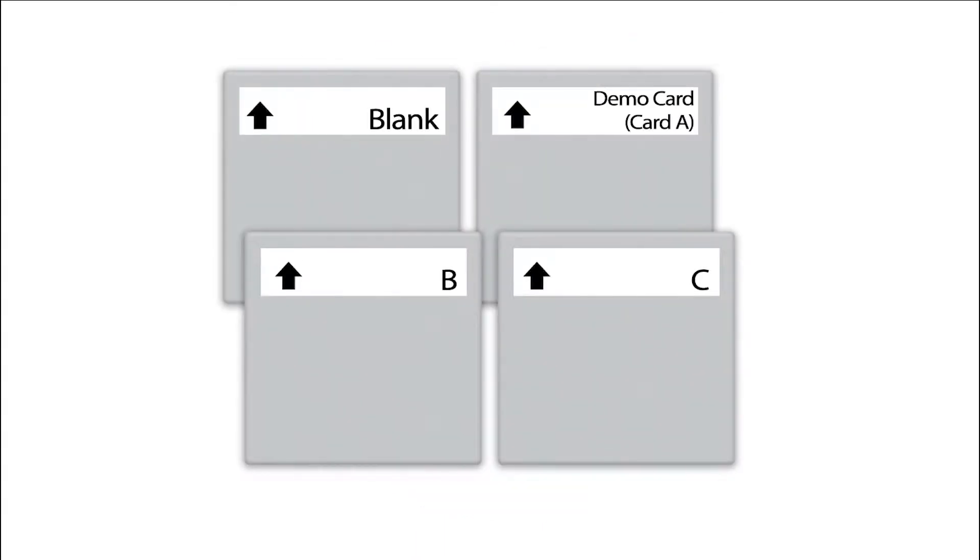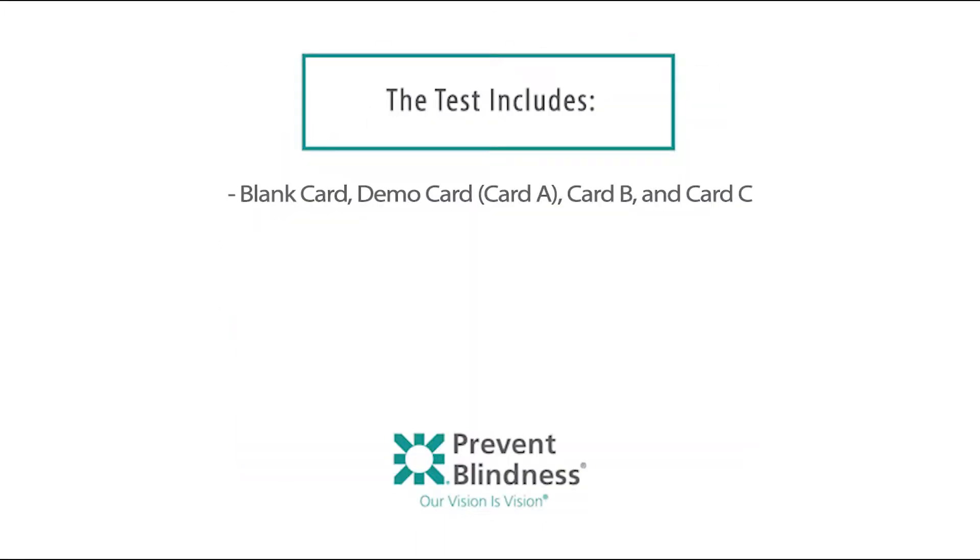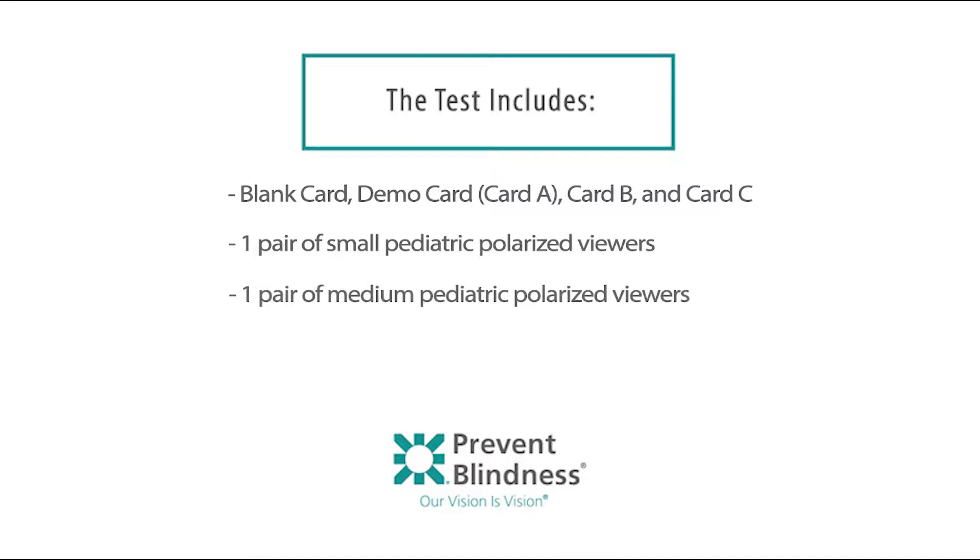Note the back of each card is labeled: the blank card, the demo card also marked as card A, card B, and card C. The test also includes one pair of small pediatric polarized viewers, one pair of medium pediatric polarized viewers, one carrying case, and one measuring cord.